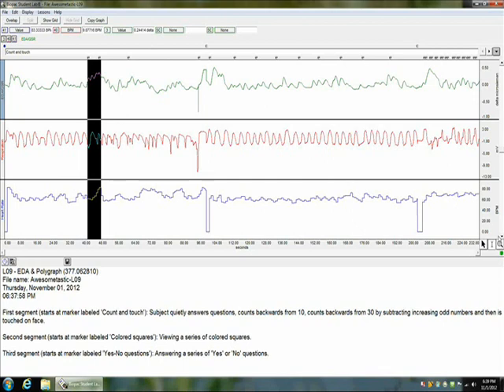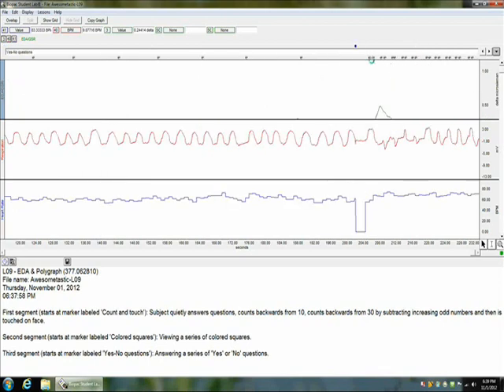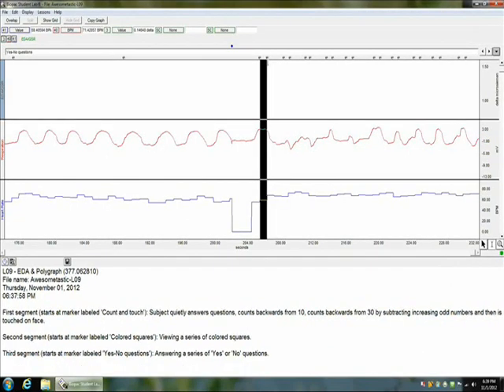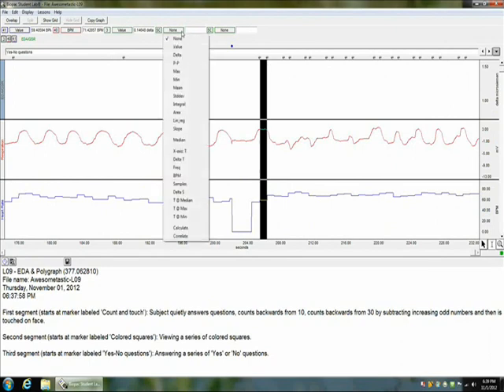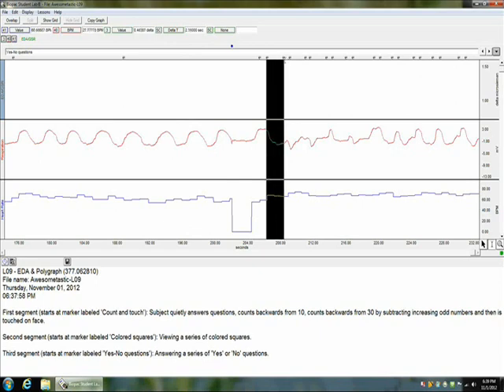To get our values for the third experiment, we're going to need to zoom in because the data points are much closer together. To do this, we can click on the magnifying glass icon next to the eye tool, and then click on our data. Then we can reselect the eye tool and drag from marker to marker again on our data. For this experiment, the area between the first and second markers is going to be where we're going to get our latency value from. But to do this, we need to add another value at the top. So we can do that by selecting one of the tabs that says none and changing it to delta t, and then it will display our latency next to it. Finally, we can select between the next two markers to find our heart rate, respiratory rate, and EDA. Once we've done this for all of our data points, we've finished the lab.